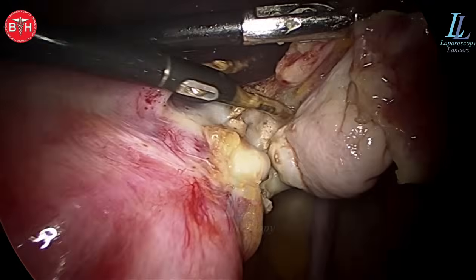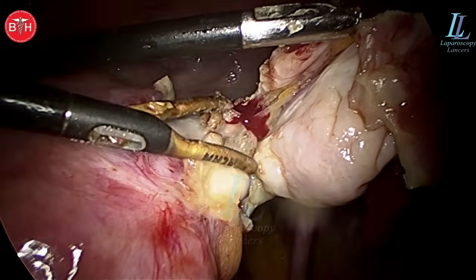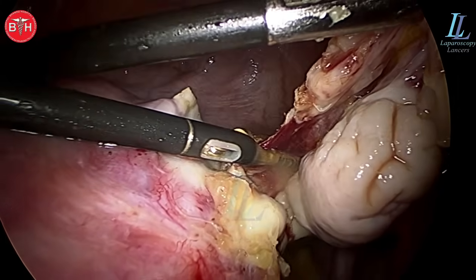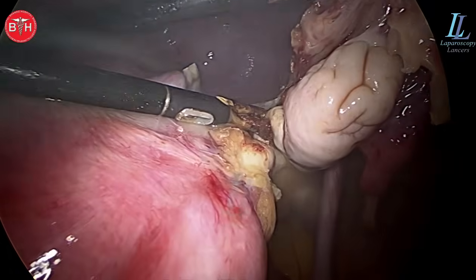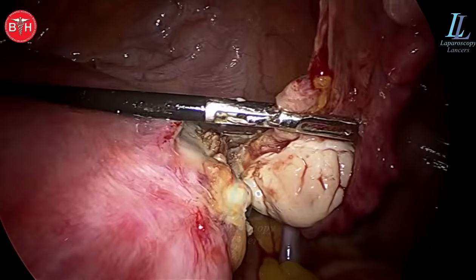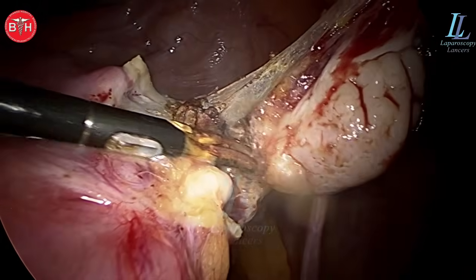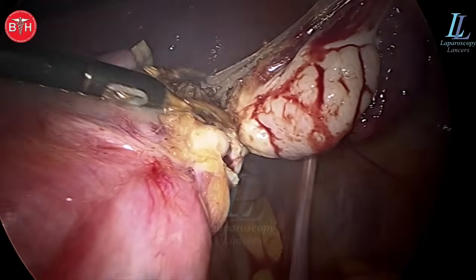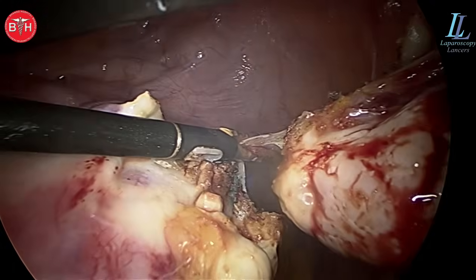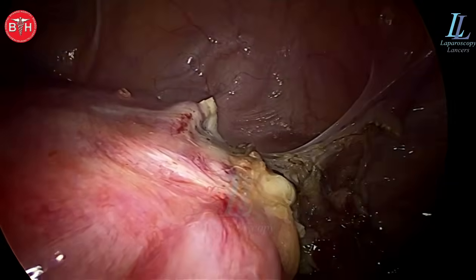The ergonomics are very important. The shoulder should not get fatigued, as a 45 to 50 minute surgery for a large uterus is actually tiring. Once you are comfortable with the ipsilateral two-port working only, you will be so comfortable that you will not feel that you have just completed a total laparoscopic hysterectomy. You can come and join us as an observer to learn the art of laparoscopic surgery, and as I always say, an abdomen of a female should never be opened.